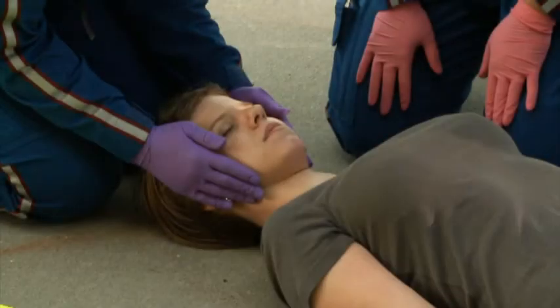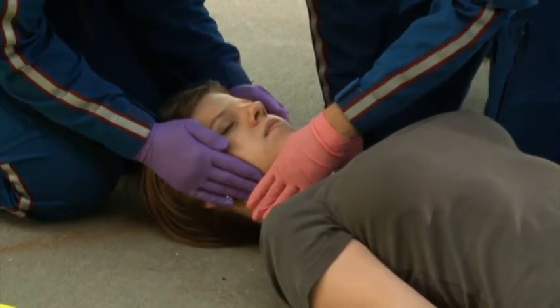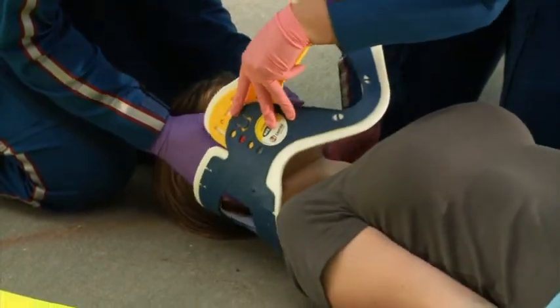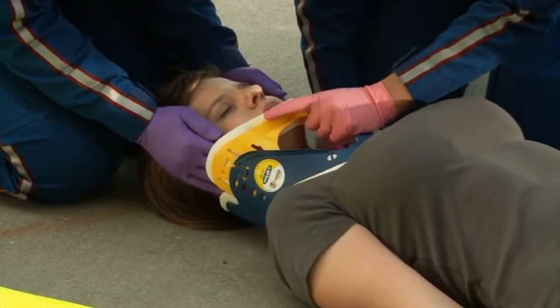This video will demonstrate the supine log roll by 3 providers onto a longboard. The first provider maintains neutral inline stabilization of the patient's head and neck. A second provider measures for and applies the appropriately sized cervical collar. The third provider places the longboard near the patient.